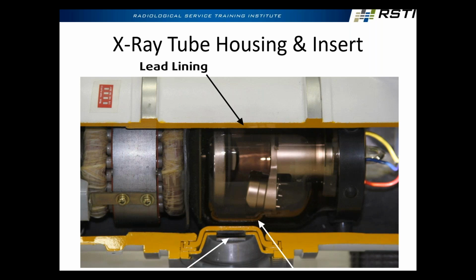All right. This solid piece here, that is the port of the tube. It's actually transparent. You can actually see through it. This part is lead as well, what we call an off-focus cone. It helps to reduce the amount of off-focus radiation. You can actually see the square port right there. But yeah, it does the trick.